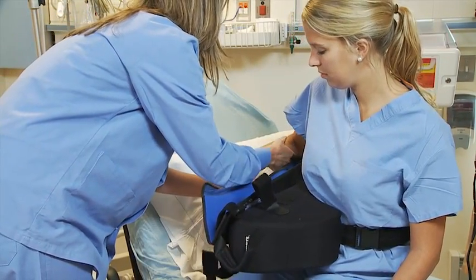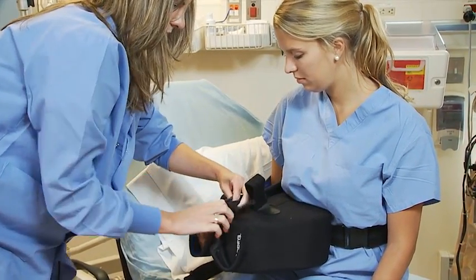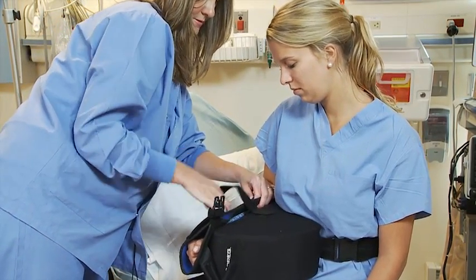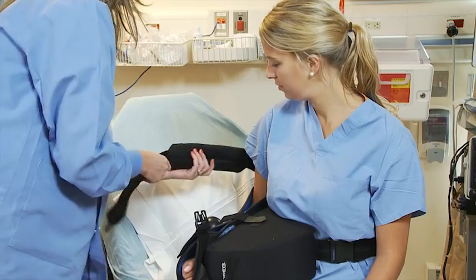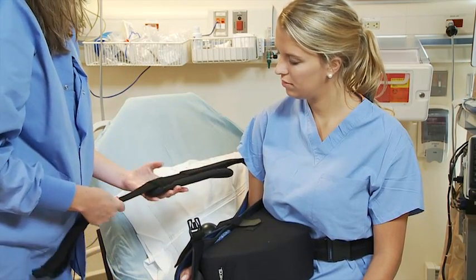Just keep your arm in this neutral position, also called the shotgun position. Use the strap to secure it. We're going to line this little strap here. The ball comes with the sling — it's meant just for you to squeeze if you'd like, just to keep your hand in motion and circulation flowing in your hand. And this is the neck strap.